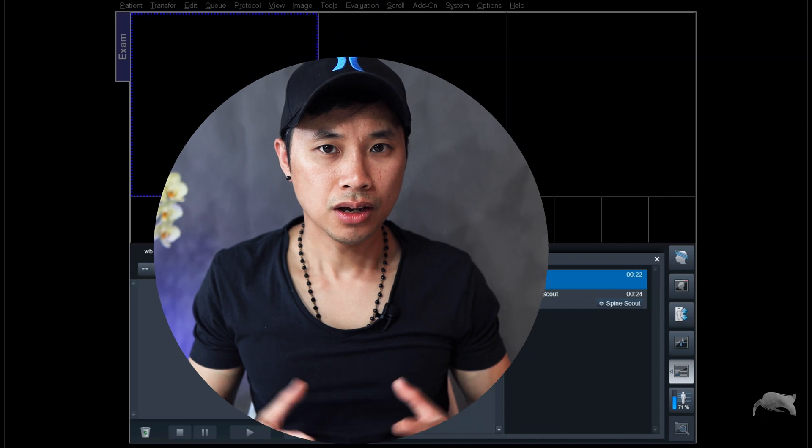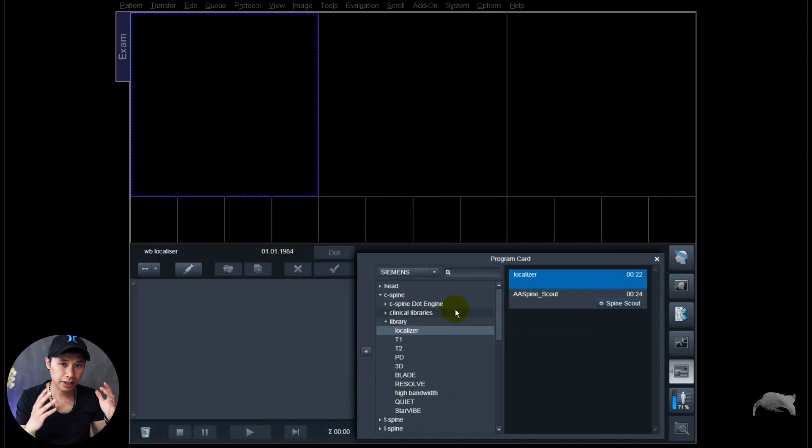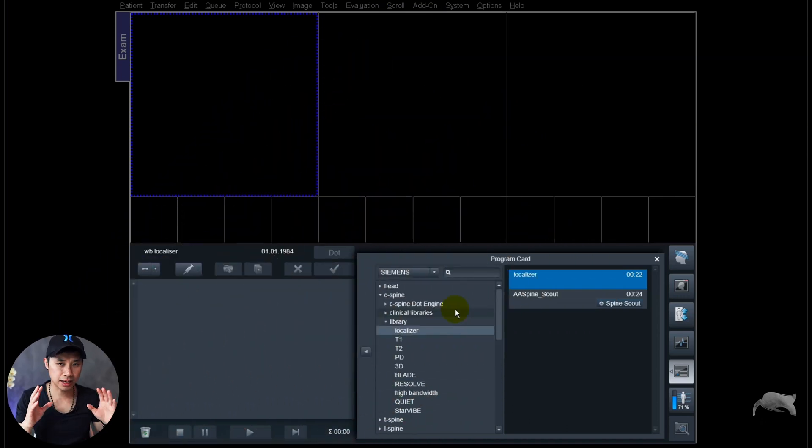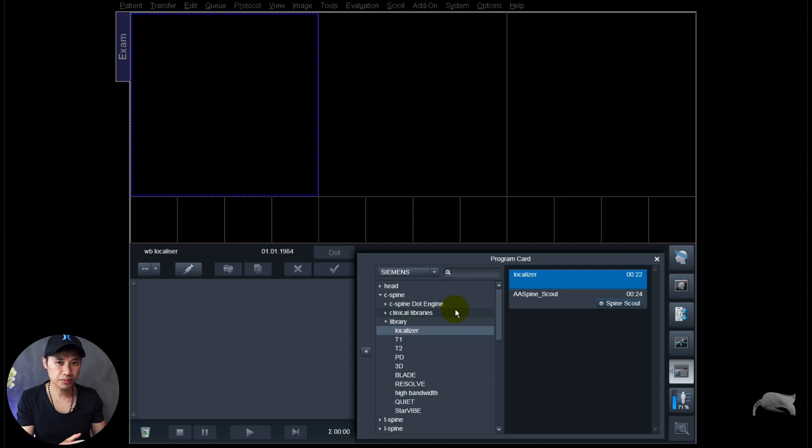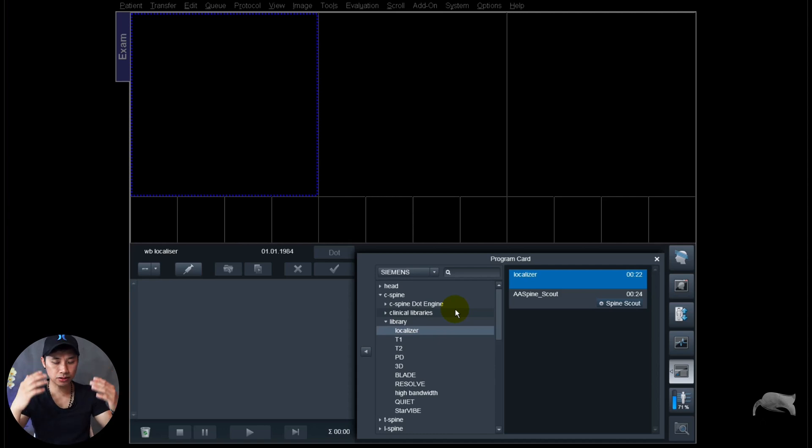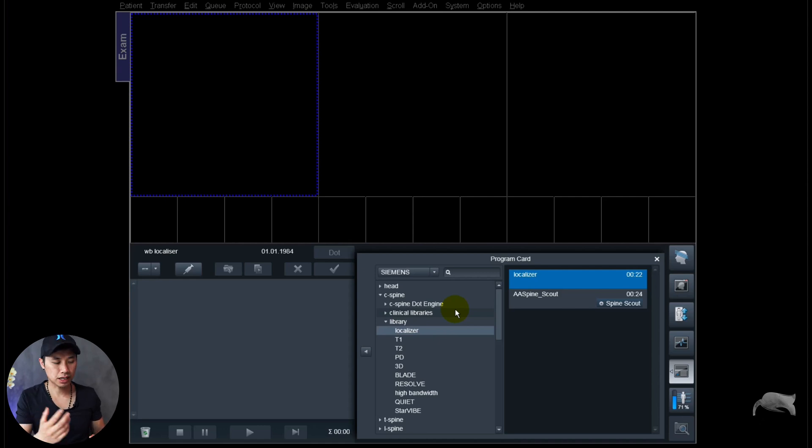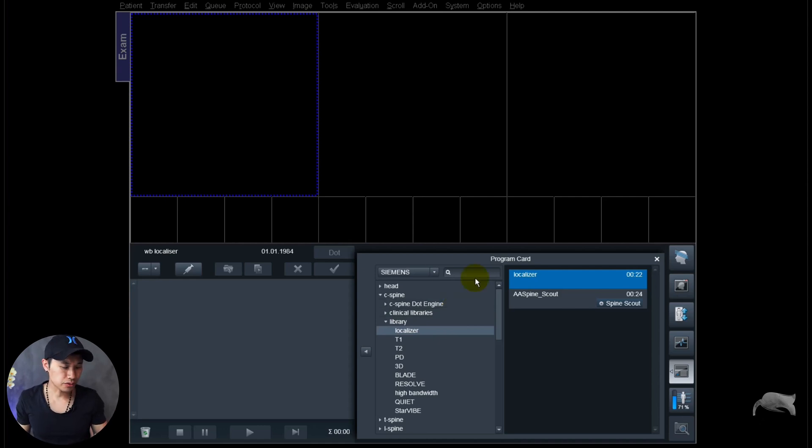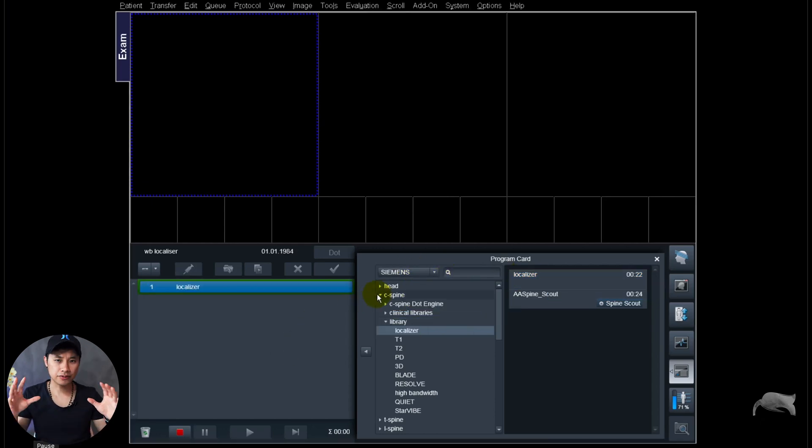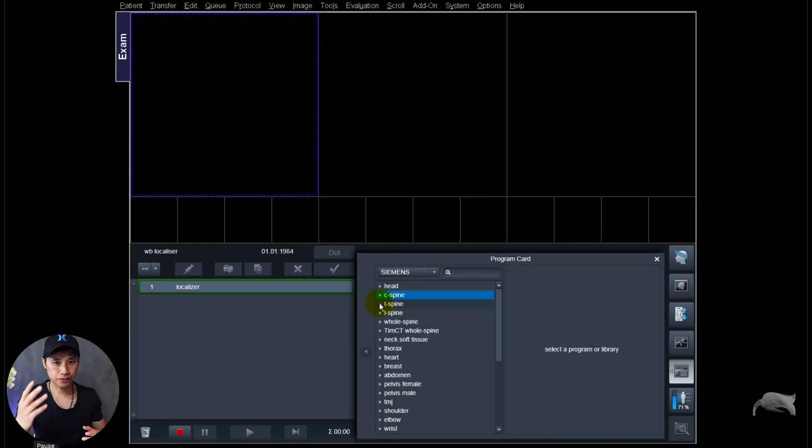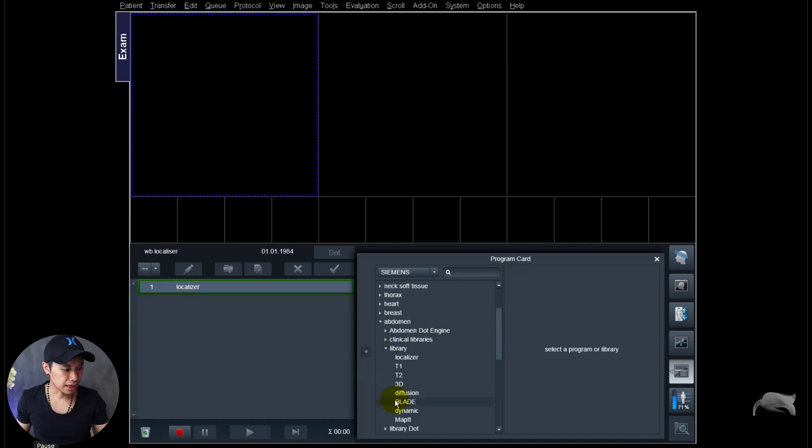Alright, we are currently at 1.5 Tesla but this doesn't matter. You can do this at any field strength, it's the same principle. So we're going to do a whole body imaging localizer from the head to the hip or just like for spine. What I'm doing here now is I'm going to go to the examination and find a localizer for the C-spine just to have an overview as a first sequence so I can show you from this basic.